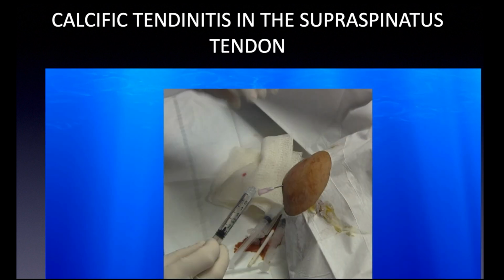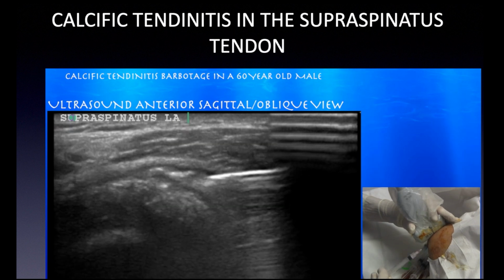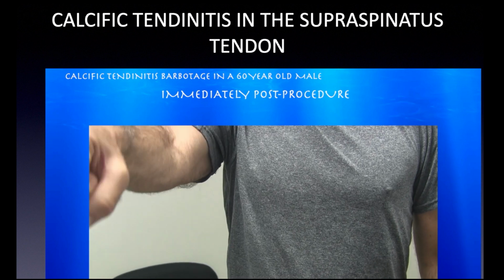And I'm not going to run through the whole procedure, but then we're just going to inject our cortisone in the subdeltoid bursa. And what's interesting for him, this is right after the procedure.